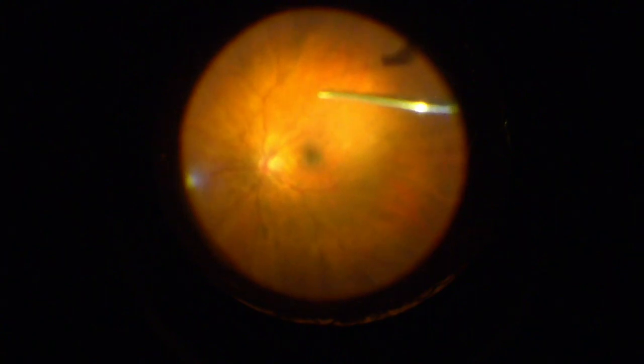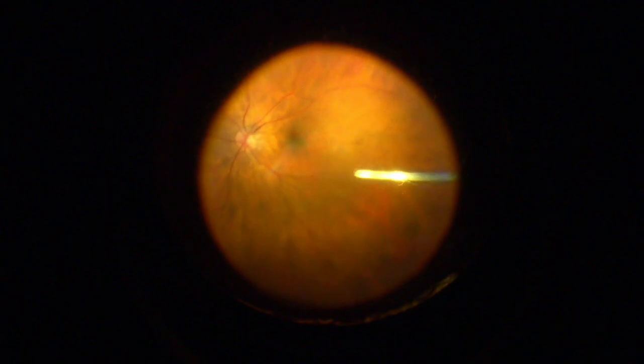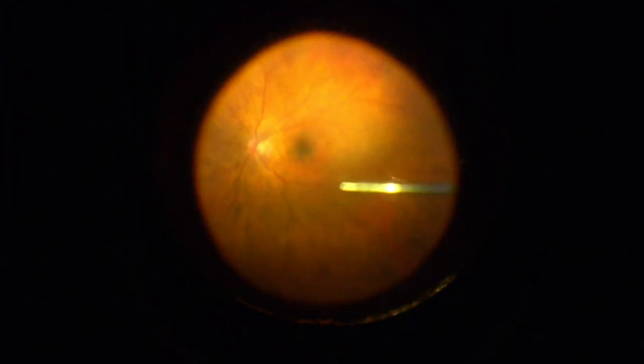So here we're starting our vitrectomy. We want to do a nice, safe vitrectomy. We're going to core out the vitreous here and then look to create a vitreous separation or confirm that. I will demonstrate using Kenalog at that point of the case, or the triamcinolone acetonide crystals, to show you how that does stain and helps you visualize the vitreous. So let's take that now to give everyone an idea of what that looks like.